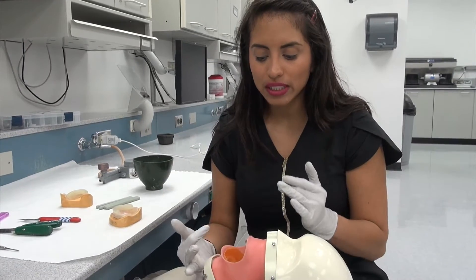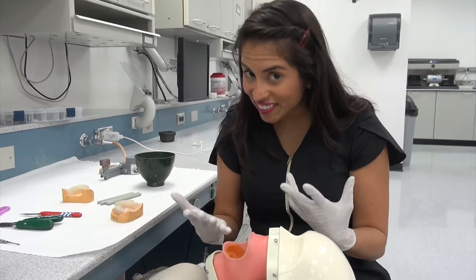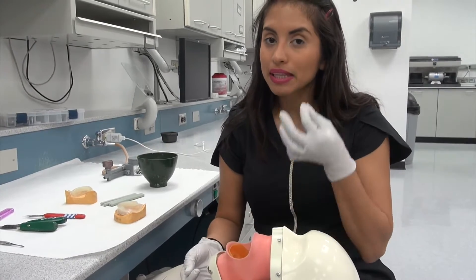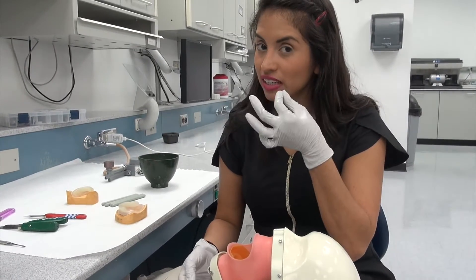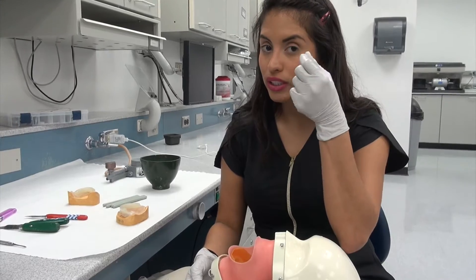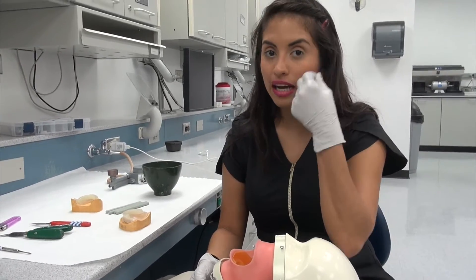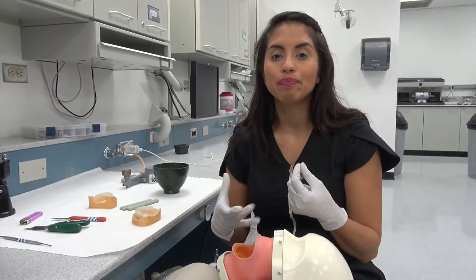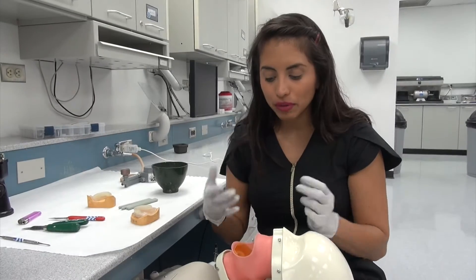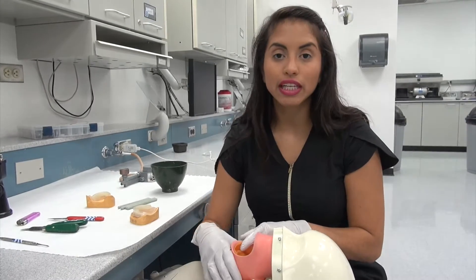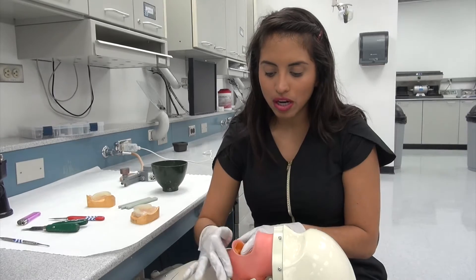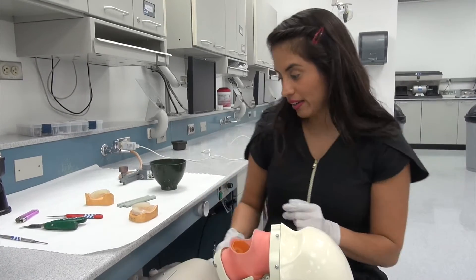One of the things that you'll notice is that these are going to be very different than the human mouth. When you're working with the mouth, you're going to be pulling the cheek upwards and out, or downwards and out, as well as making them make several movements. Here with Dexter, you're not going to be able to do that. So, we'll be manipulating the cheeks the best we can.